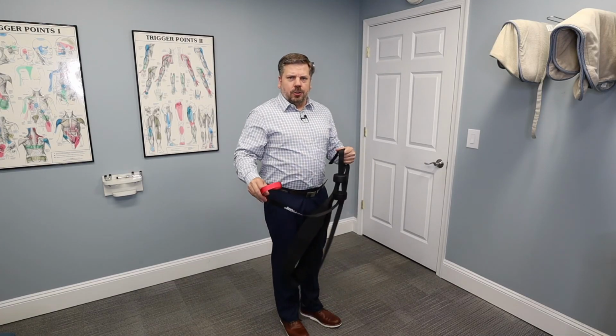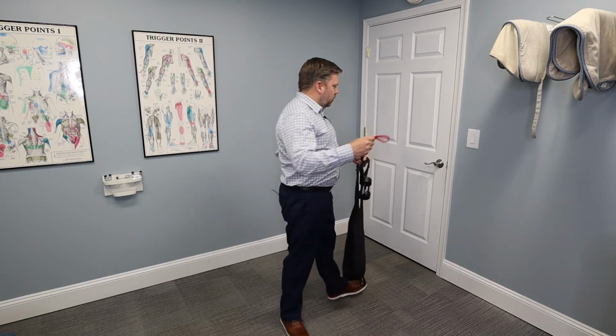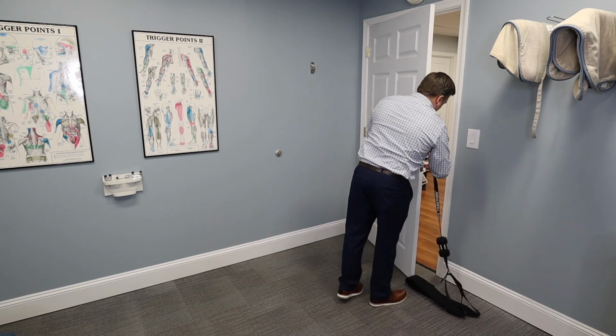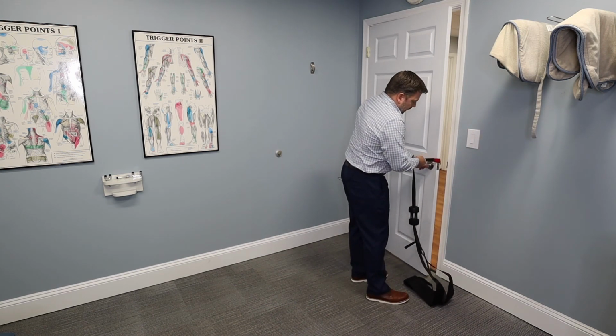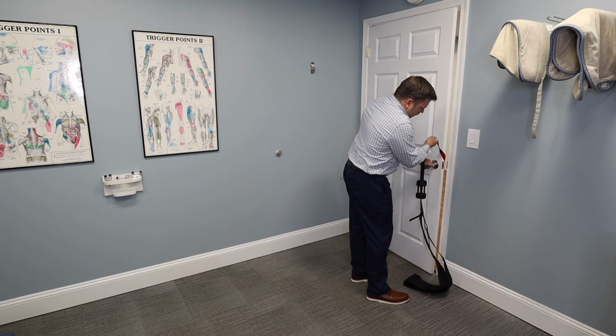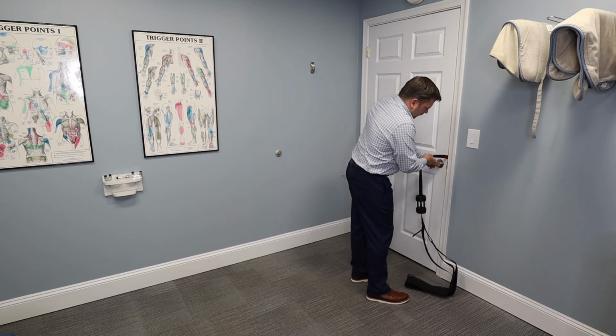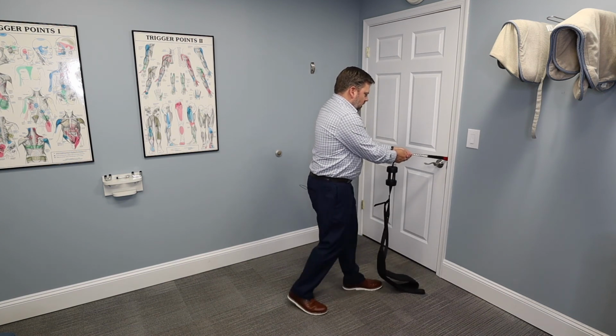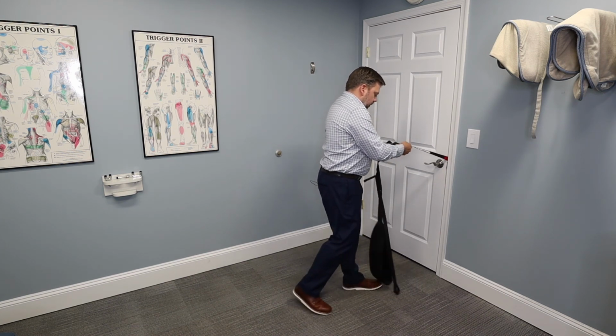Okay, so what we're going to first do is secure this loop around the door handle. So we're going to open up the door, put it on the door, and then make it flat and secure it above the actual locking mechanism. There we go. And then I want to pull on that unit just to make sure it's firmly in place. That looks good.